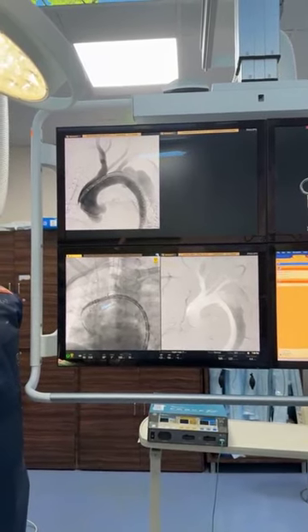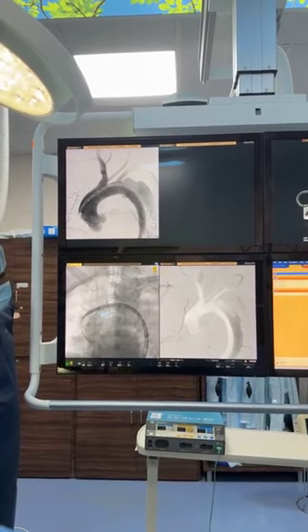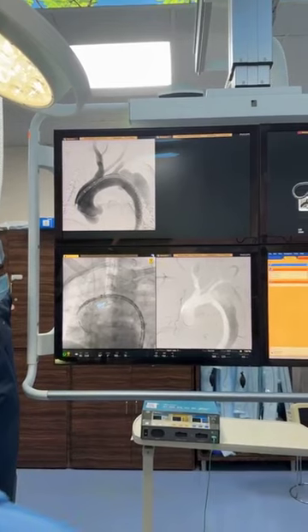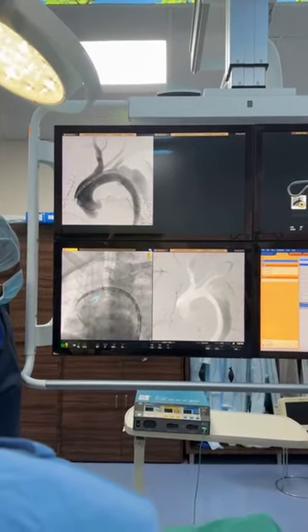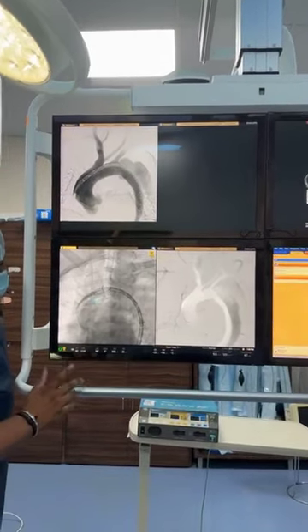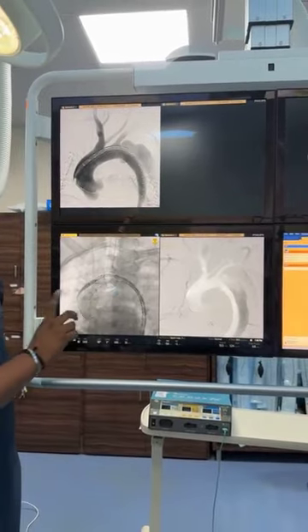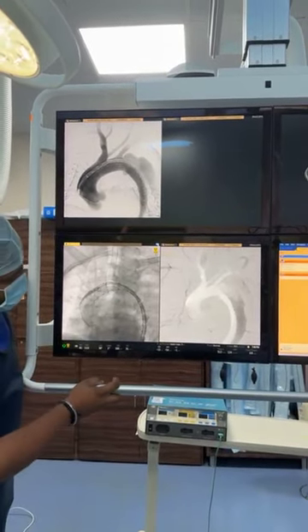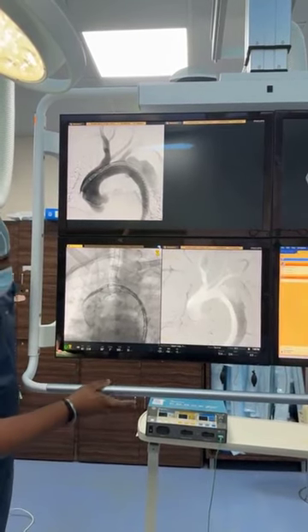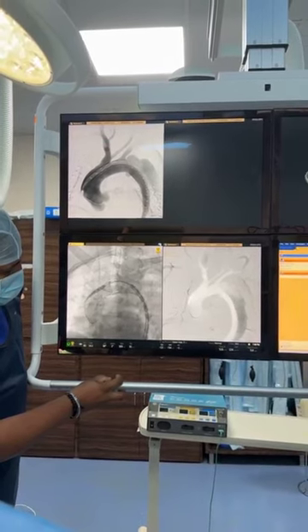Okay. As you see, automatically push over. So we just have to hold our horses. Take one check, sir. No, no check. Partially decline. Okay, 1 second. Slightly come back and we'll go for rapid. Slightly come back, sir. Okay, turn on the trigger and we'll go for rapid. Keep going.